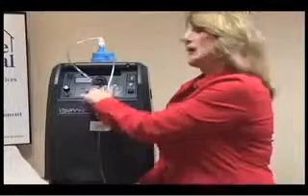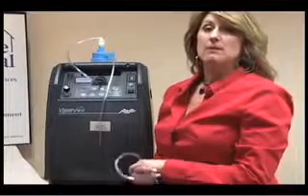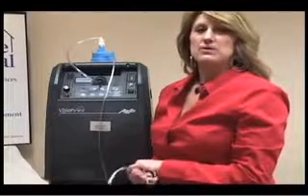If there is a light and an alarm coming from your concentrator, you will go to your backup tank. Then you will troubleshoot your concentrator. Always please check that your plug is plugged into the wall and also that your electricity is on.